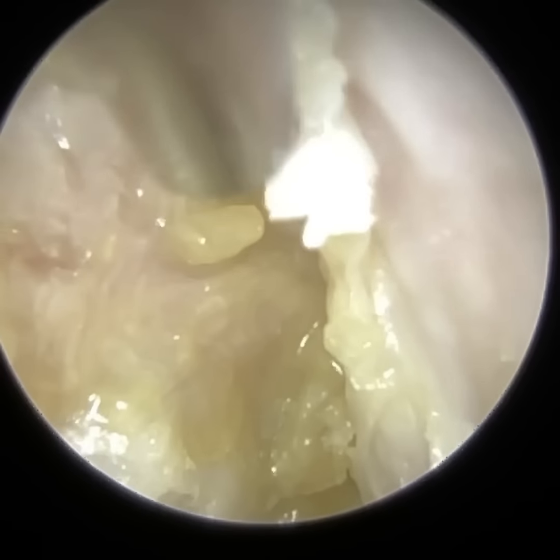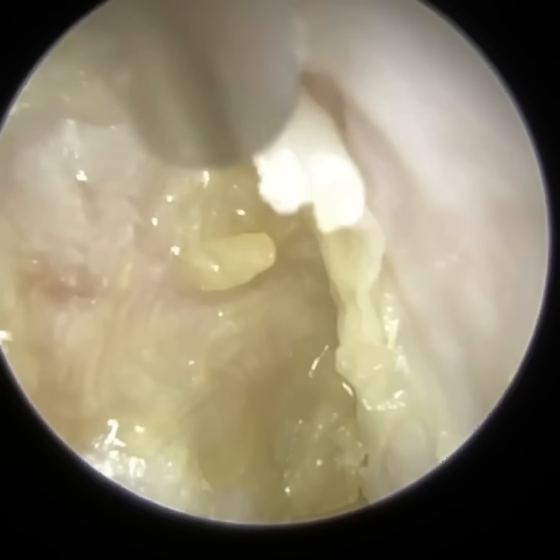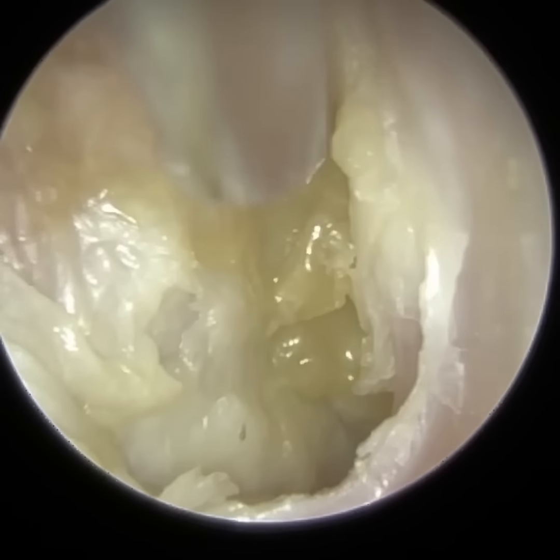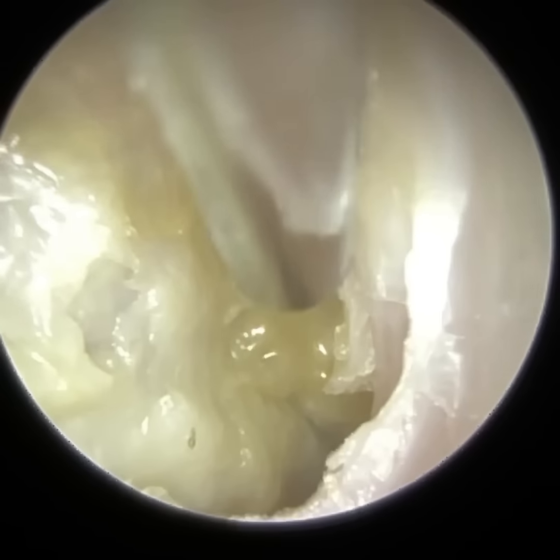There is going to be a bit of debris left, but you'll see at the moment you can't really visualize the eardrum. You've got all this dead skin attached to the eardrum, so once I peel it away, you're going to get a better view of the eardrum. The patient was brilliant, very still.